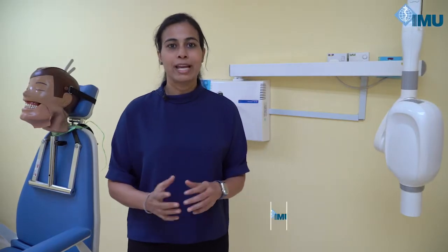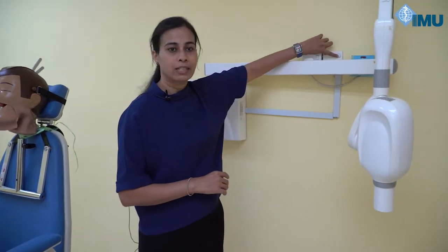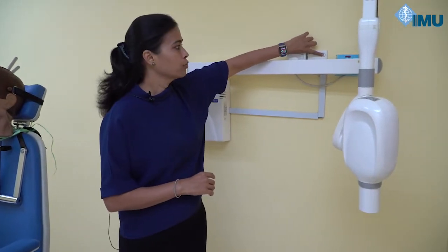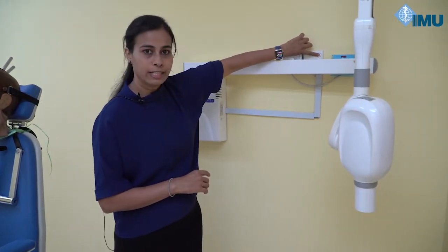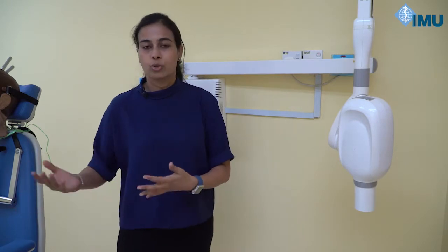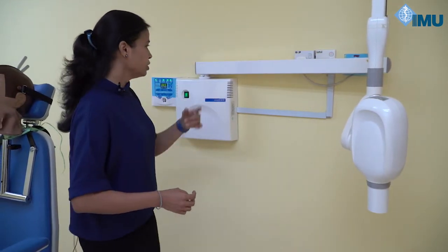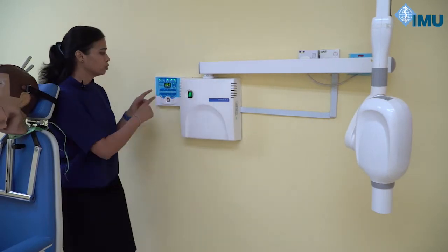Hi students, today I'll be demonstrating the bisecting angle periapical technique. Before we start any technique, make sure you turn on the warning light. This is the switch for the warning light, so that outsiders can know that we are performing radiographic techniques inside the radiology room.